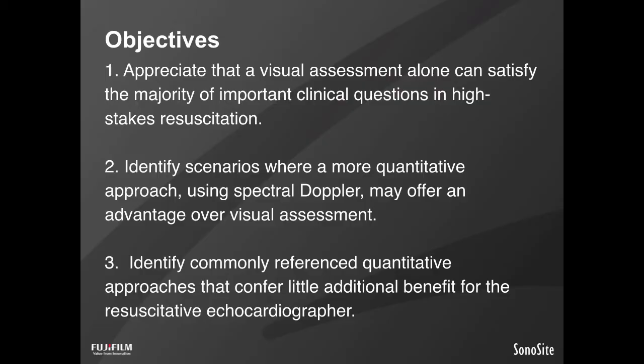The objectives for today, as mentioned, are to appreciate that the visual assessment alone is 90 to 95% of the time all that you need. And that remains true no matter who you are, I believe, if you're practicing acute care medicine and you need to answer big, bad hemodynamic questions at the bedside. A visual approach is all that's needed. Put the calipers down. However, we will identify a few scenarios where quantitative approaches may be demonstrated to be useful.